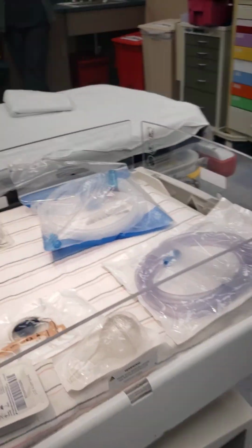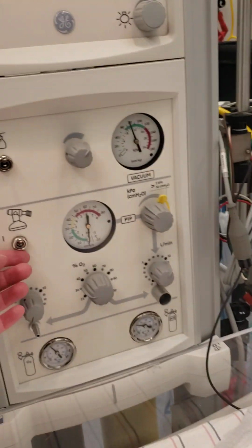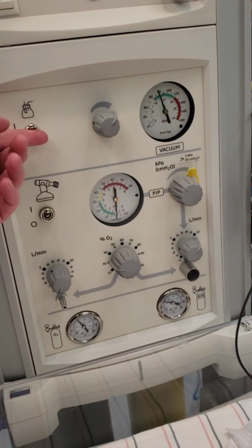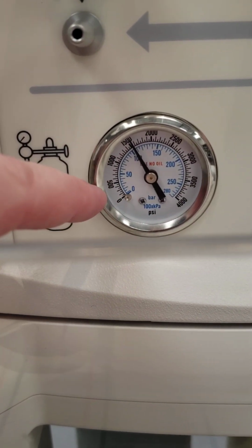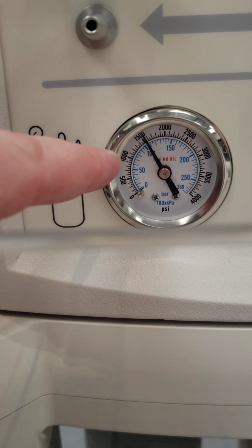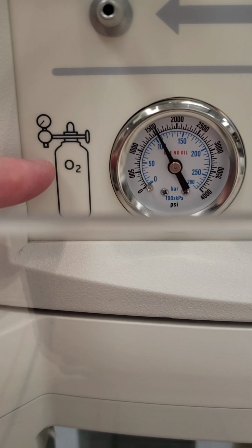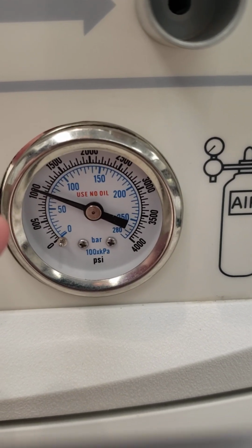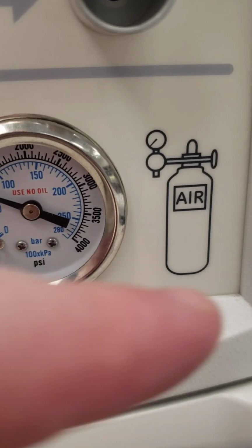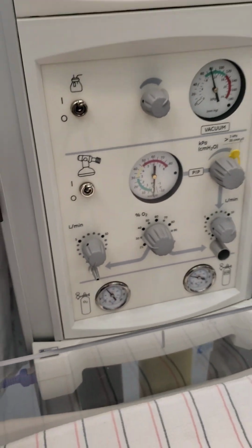And now we can go back around the front and we can see that it's on. We would flip this switch up and this switch up. We're going to assess here. This means that we have oxygen in our tank. If this needle drops to 1,000, that means that the oxygen tank would need to be changed. And our medical air tank is around 1,000, so that one could probably benefit from being changed as well. And it'll tell you the difference between medical air and oxygen. I'll show you how to use this better here in just a second.